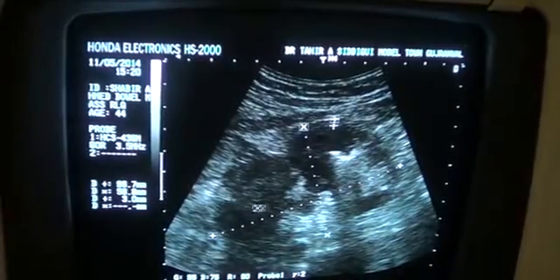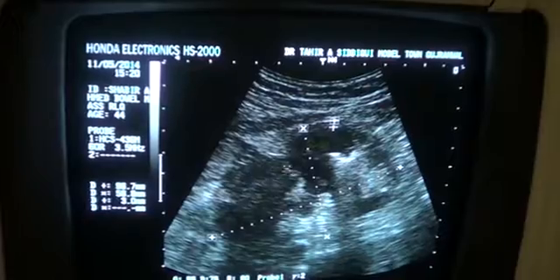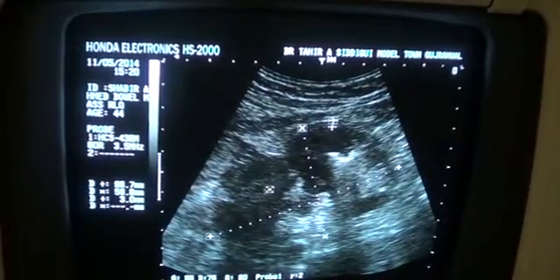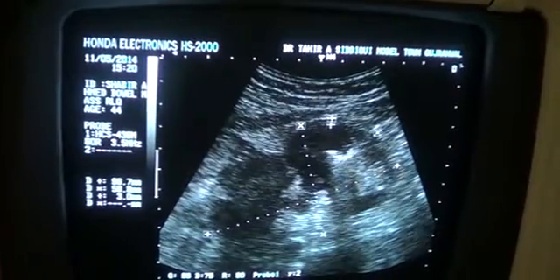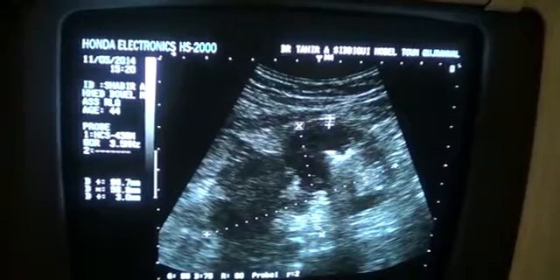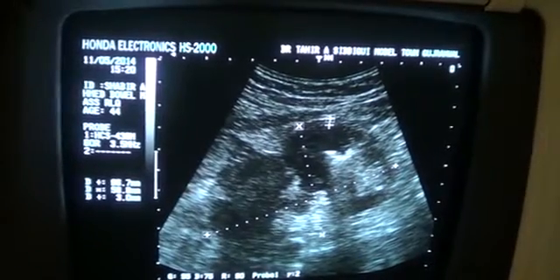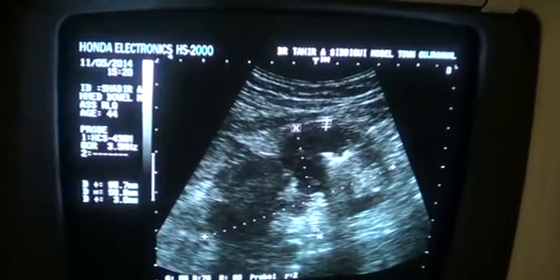This is the sagittal section. Now there are multiple echogenic areas. This is all fluid, and there are echoes within this fluid. It's not a clear fluid, and this we are seeing in the region of the right iliac fossa that extends into the right lower abdominal quadrant. This is a bowel mass.